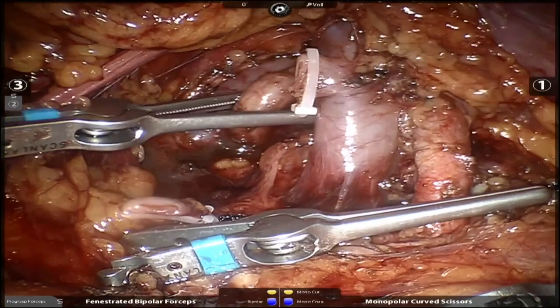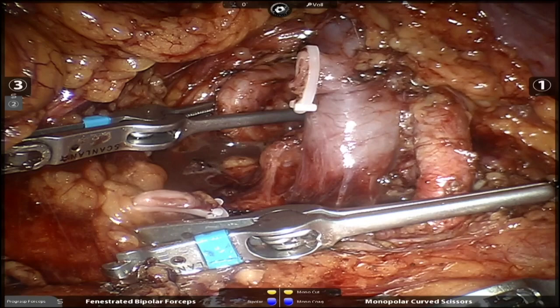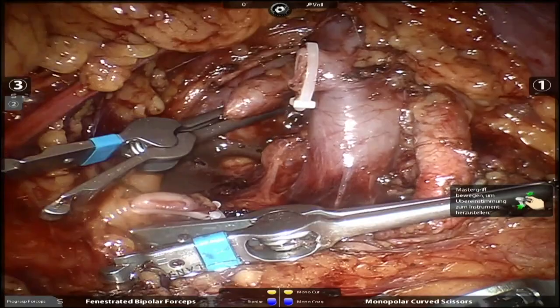Okay, Brandon, we have the bag. We have the extraction sac ready to go. All right, so we're going to cut. Bag specimen, go to needle drivers, and then we're going to go with a 4-0 stitch first. The 4-0 stitch, Brando? Long one. Okay, here we go. Okay, so that's a vessel. God knows what it is.